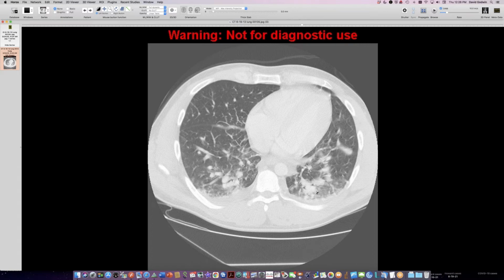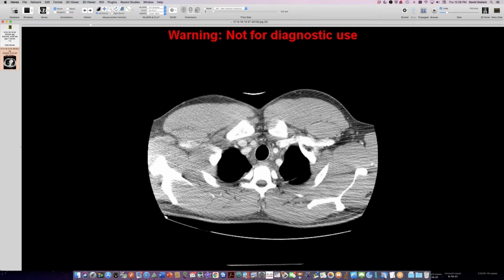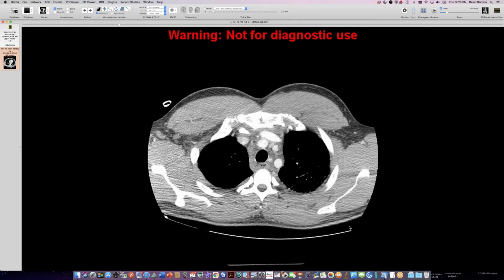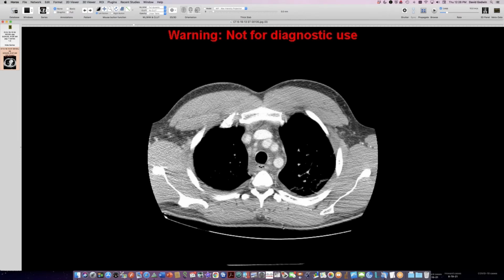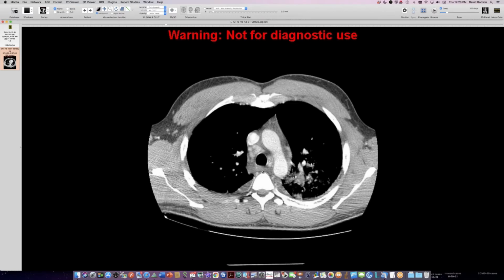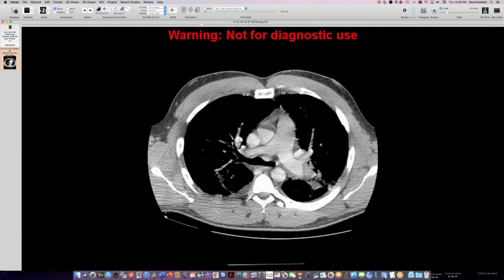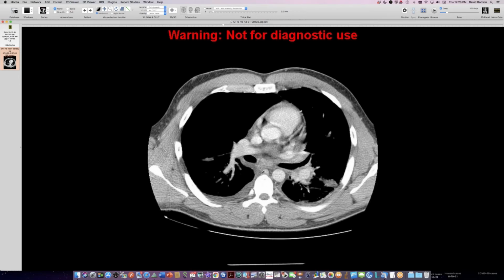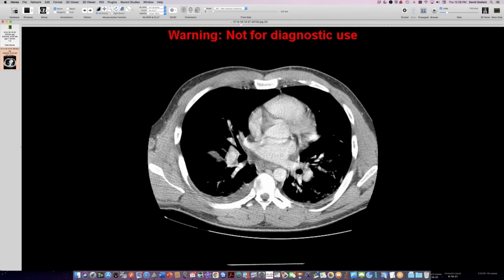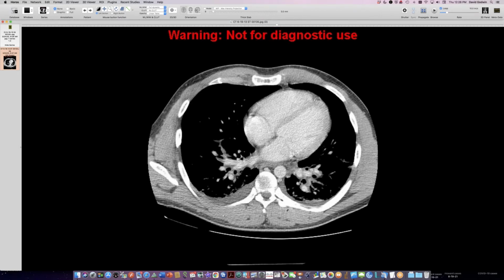So let me show you some mediastinal windows. You can see this is a vigorous outdoorsy sort of person here with big muscles. There's quite a bit of lymphadenopathy and kind of smudgy looking mediastinal fat. So it looks as if there's a lot of inflammation going on here. So chest pain, fever, shortness of breath, severe headache, and pleural effusions in a previously healthy guy who was not having any problems on his infliximab therapy.